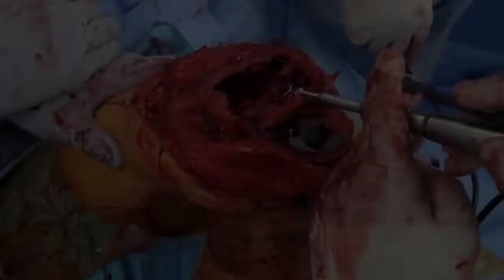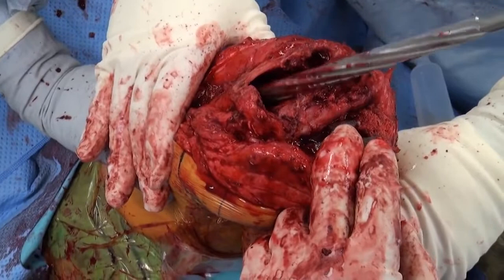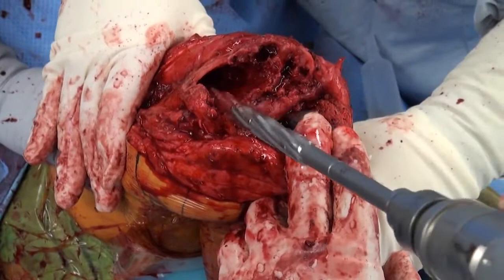A burr is used to fashion the distal portion of the femur to accept the large cone, which must be invaginated into the large cavity already present in the distal femur. An iterative process is used with burrs and reamers to smooth the bone to the shape of the cone, which will be inserted inside the bone. Effort is made to minimize the amount of bone removed from patients who are already bone deficient, so these cones are used in cases like this.